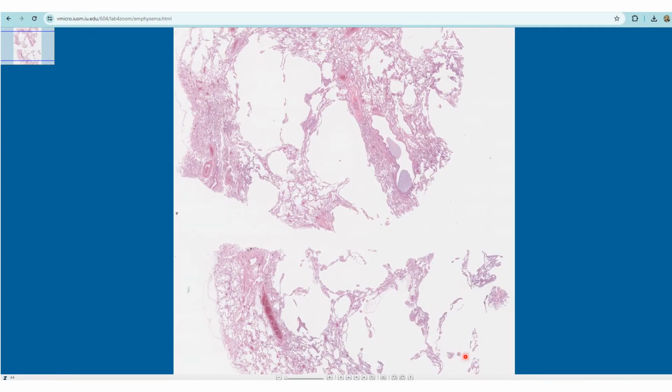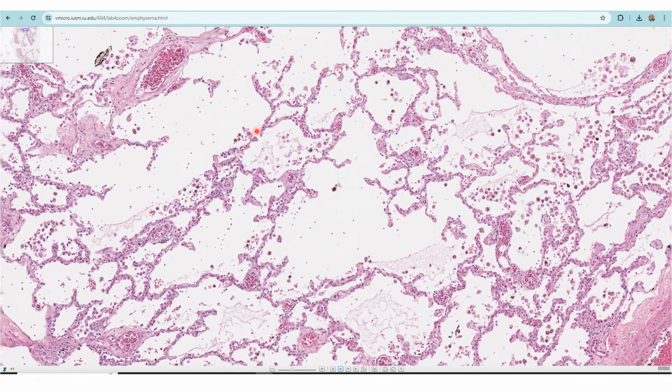Next is emphysema. You can see a section of the lung parenchyma, and just focus on this area, because you can see there's an alveolus there and there. The normal one should be as small as this, but this is enlarged, and the reason why it's enlarged is that you can see an alveolar wall that is being destroyed there. There's an alveolar wall there, and it has all become destroyed. So there's destruction of the alveolar wall, making the air space become large.